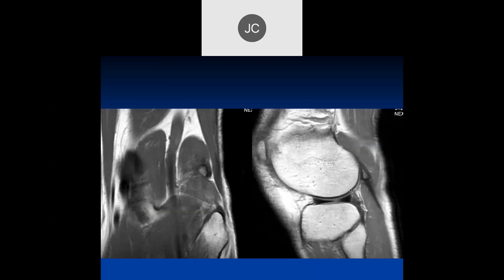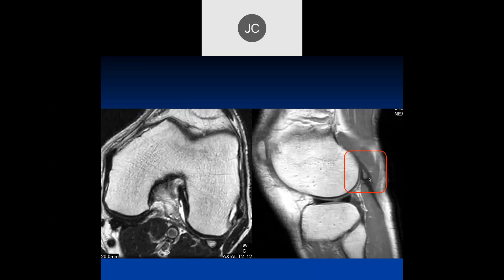On this coronal and sagittal T1 of the knee, we can see an accessory ossicle — a fabella. The fabella, which we very commonly see, is actually in the lateral head of the gastrocnemius tendon. It's a normal finding, and most of us don't even look at it. I generally don't comment on it in the report.